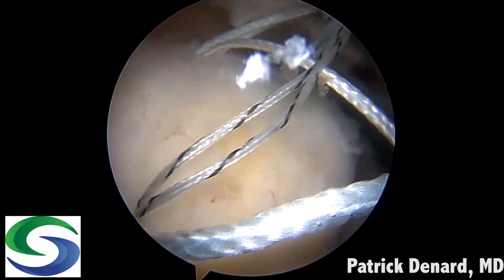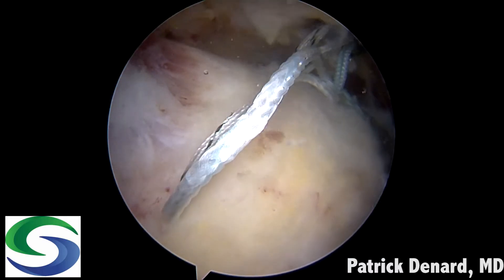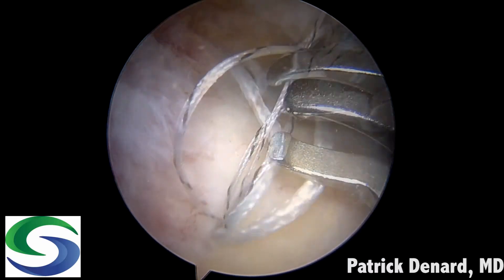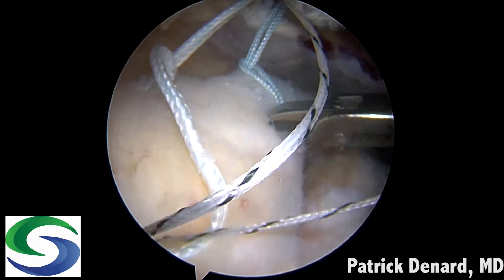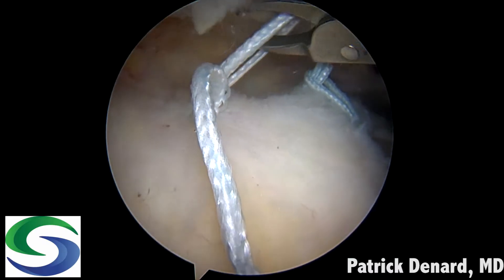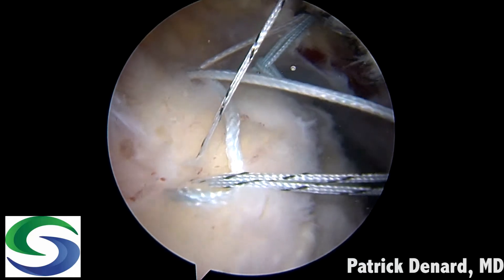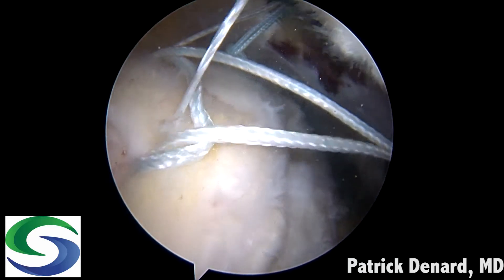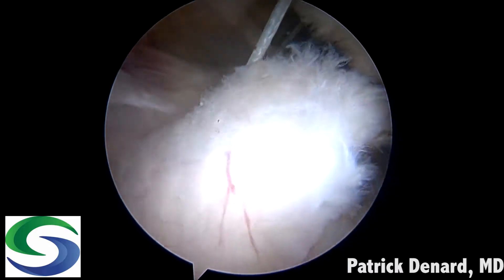This engages the knotless mechanism, but we don't want to seat the suture completely — we bring it down just above the rotator cuff. Then we repeat the process: the loop from the posterior anchor is used to shuttle the suture from the anterior anchor into the posterior knotless sheath. As seen here, pulling up on that suture delivers the number five suture into the posterior sheath, and now we've created our double mattress suture.